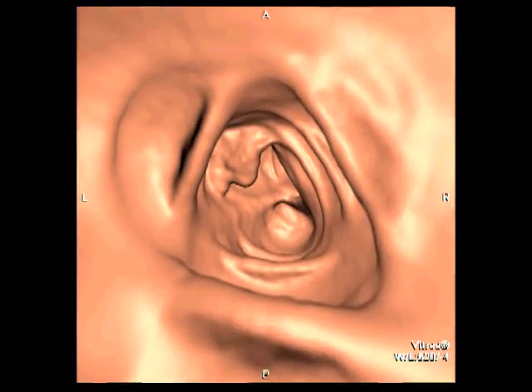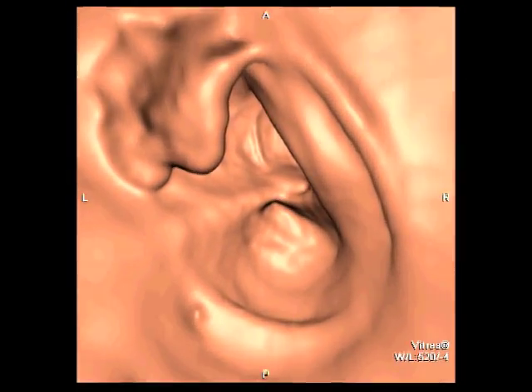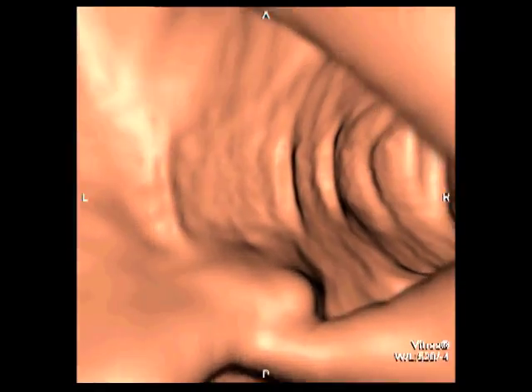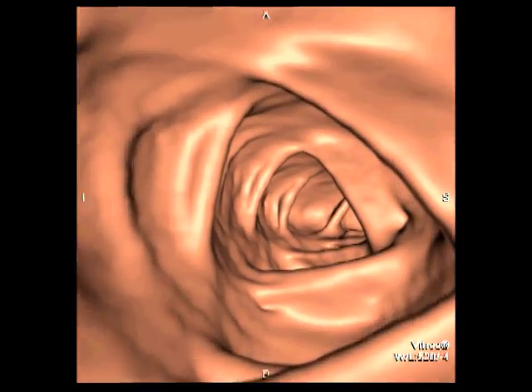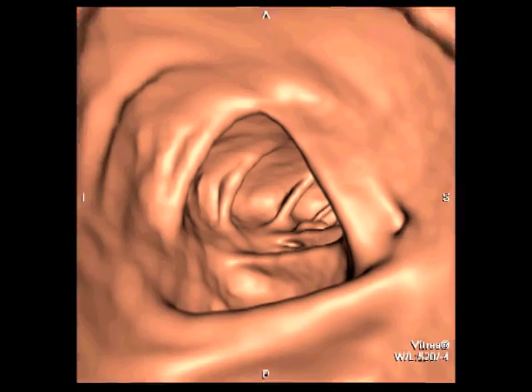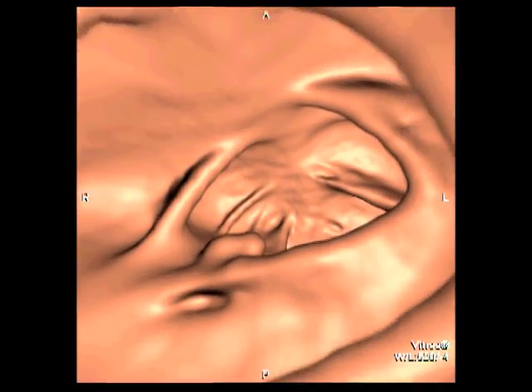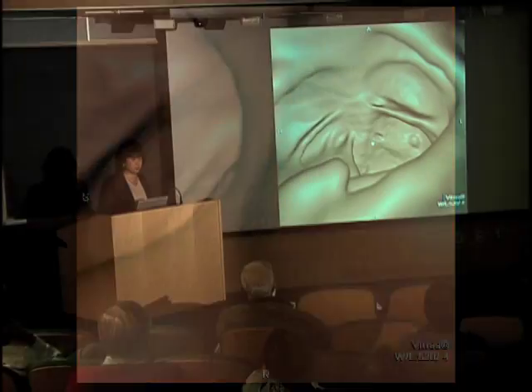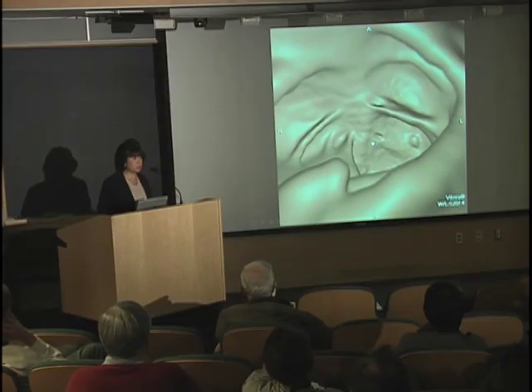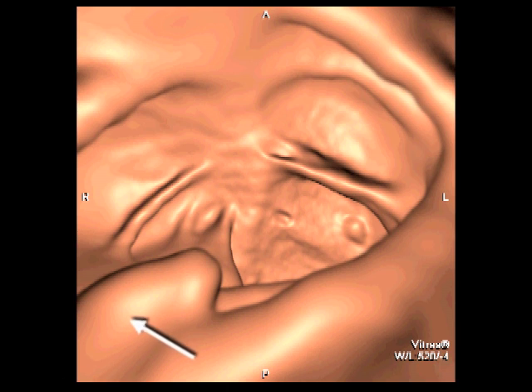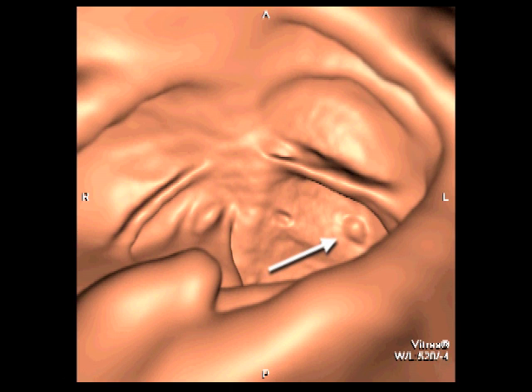This is the traditional fly-through from that CT scanner data. This happened to be a cancer, but this allows us to travel through the colon, similar to what a gastroenterologist would see as they inserted that scope into your colon. We're able to pick up polyps — you see one here — as well as this bump against the far wall.